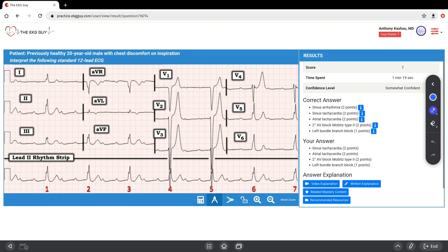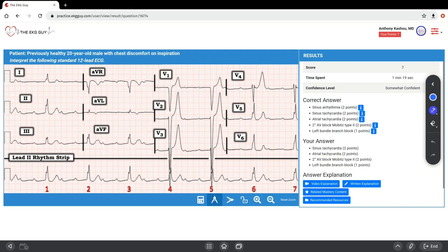In the sinus-conducted beats, the PR interval is constant but prolonged, meaning above 200 milliseconds. In this case, it's about 440 milliseconds. There's also non-conducted sinus activity, meaning dropped beats. This is consistent with second-degree AV block Mobitz type 2, presumably with 3 to 1 AV conduction.